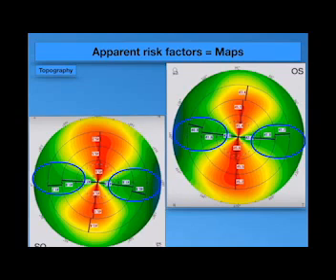Then at the center is 45.4. I'm talking about the picture on your right side. Okay. When you cross the center going to the inferior part of the bow tie, you will find that the figure at each point is almost the same as its coinciding point in the upper part. It's 45.6, 45.5, and 45.2.